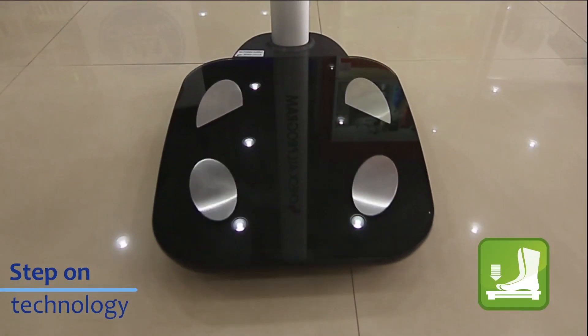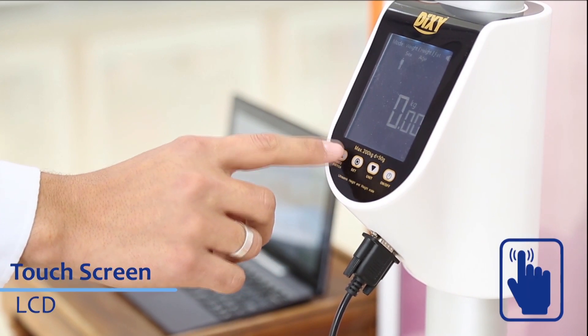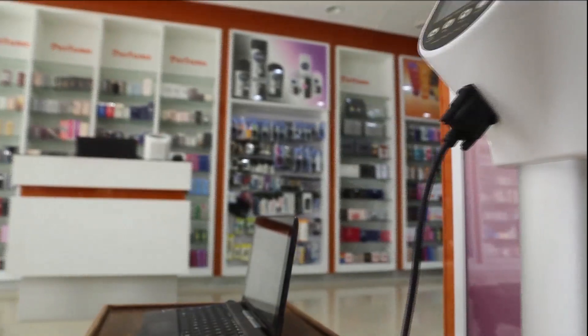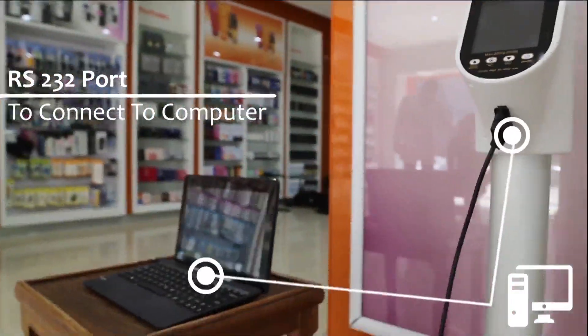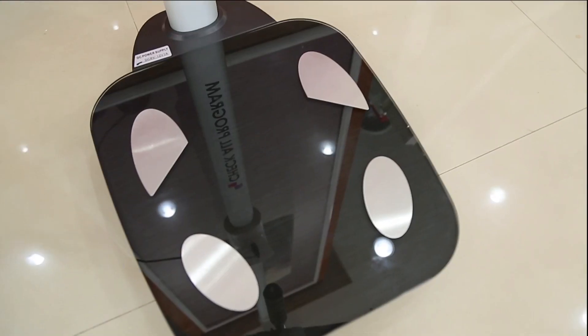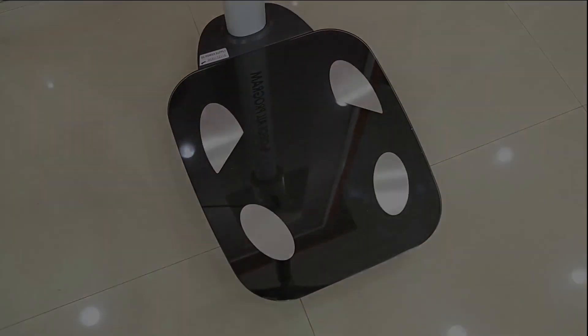The scale can start by Step-On technology. Dixie Check-All BYH-03 has a wide display touchscreen LCD. It is supported by an RS-232 port, which can connect to a computer to save results and print them from the computer. The wide safety glass platform makes it easy to clean and adds more value to the scale.